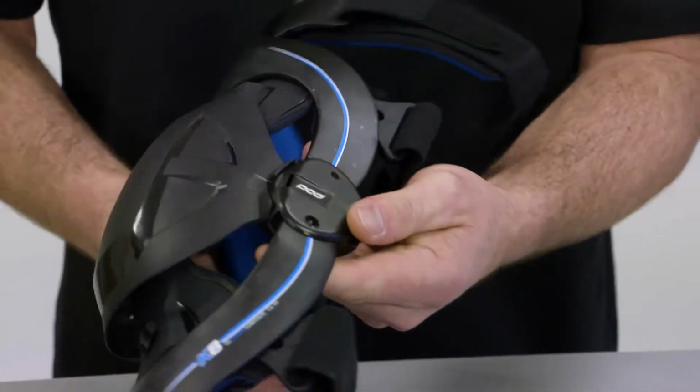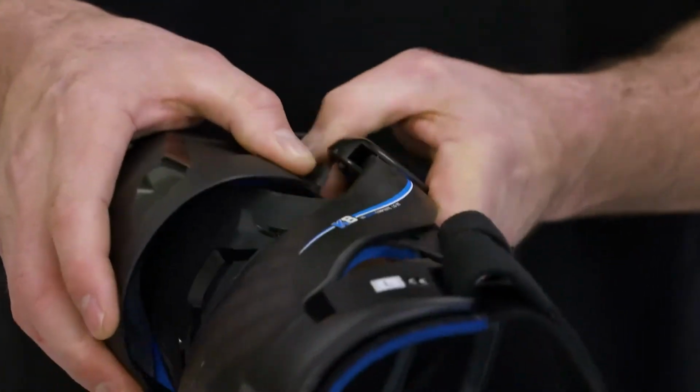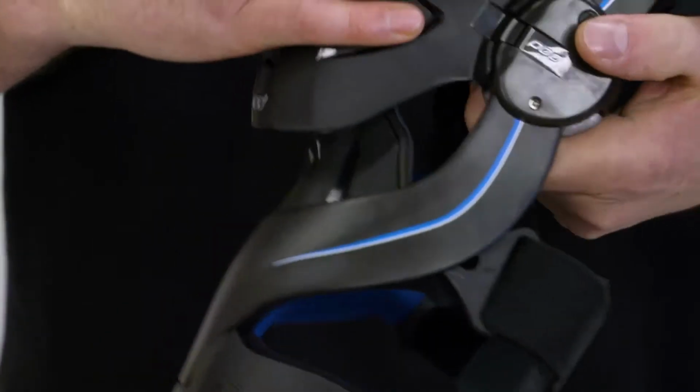To remove the patella cup, it's very simple. There's a tab on the inside of the housing. Press down on that tab and pop the patella off. Repeat on the other side.